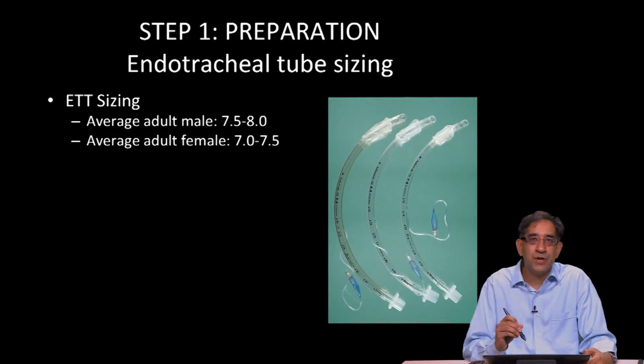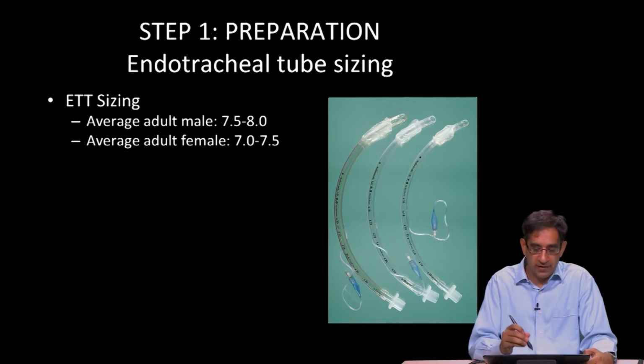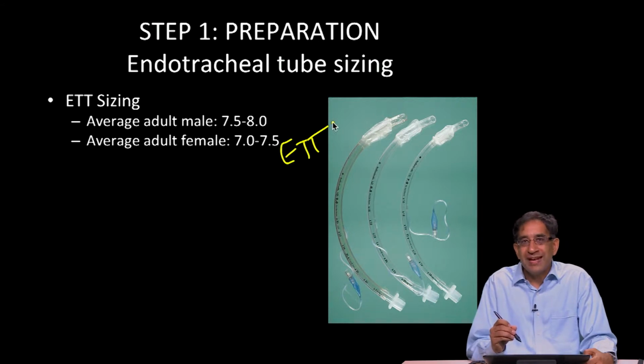We talked about endotracheal tube sizing. Generally, in the average adult male, you're going to want to get a 7.5 or 8.0 endotracheal tube size. In the average adult female, it's going to be 7.0 to 7.5 in terms of the endotracheal tube size. For children, it really depends on their weight.